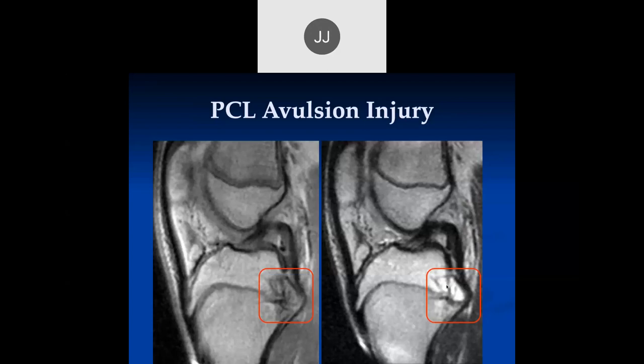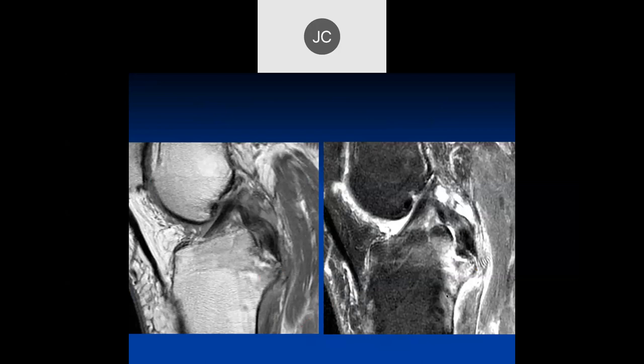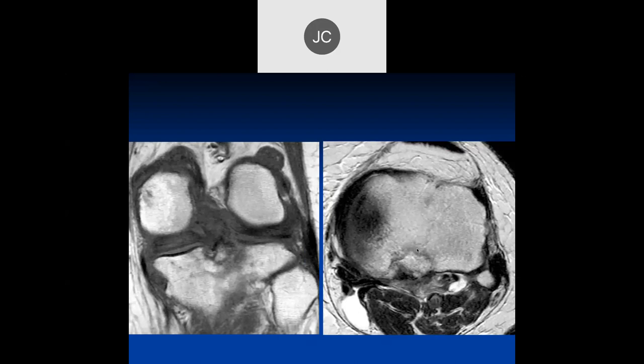I don't see blood, though. You see a lot of edema in the bone - I'm talking about edema outside the bone. We have two sagittals showing another avulsion of the distal attachment of the PCL with edema. This is an adult rather than a teenager. Here you can see that avulsed fragment back here where the PCL attaches.